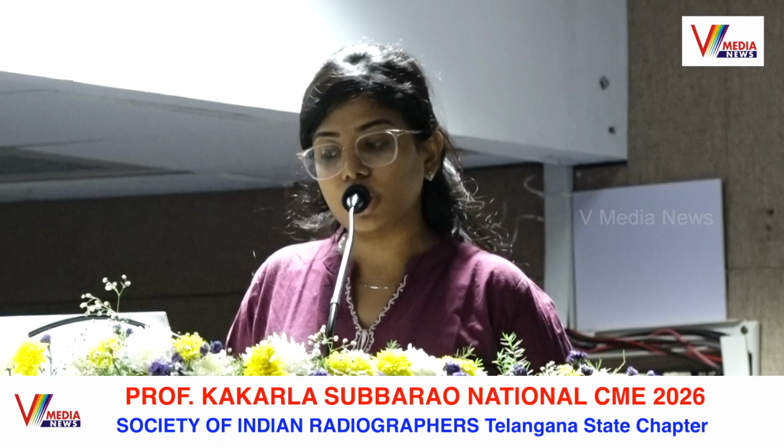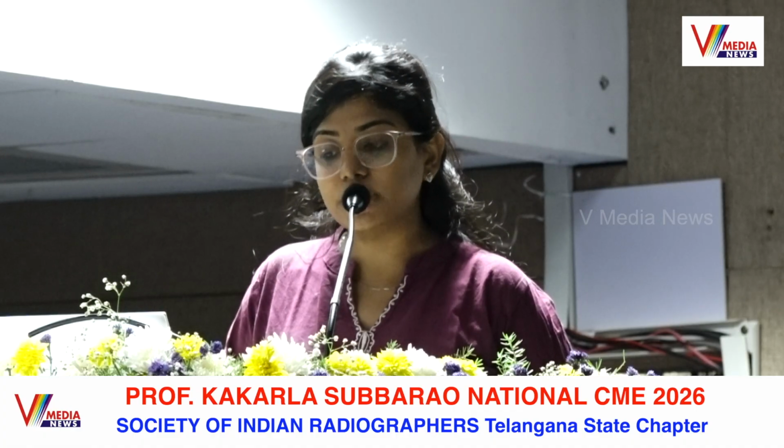And nitrates, that is sublingual nitrate, 400 to 800 microgram of nitroglycerin on the table 5 minutes prior to the coronary CT angio. After the patient is on the table, patient positioning is very important: supine with arms raised above the head and the heart centered within the gantry. The horizontal positioning laser light should lie at the junction of the anterior one-third and the middle one-third of the patient's thorax, both arms above the heart.